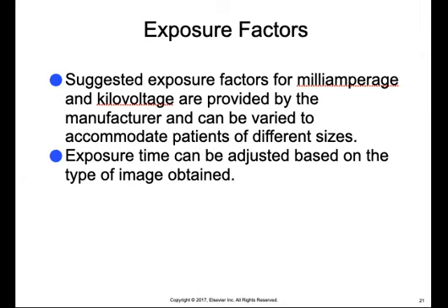Exposure time can also be adjusted based on the type of image obtained. The panoramic imaging exposure time varies depending on the receptor and the X-ray unit, but typically ranges anywhere from 10 to 30 seconds.